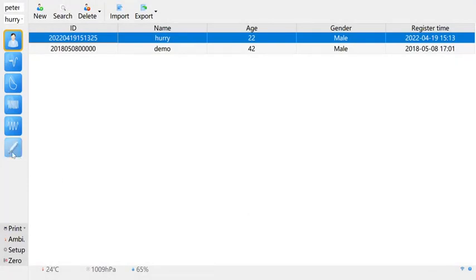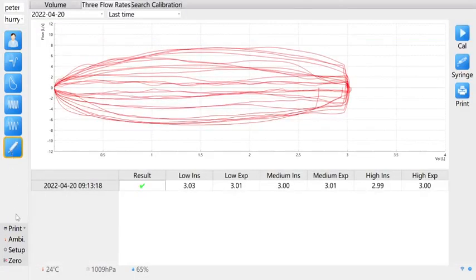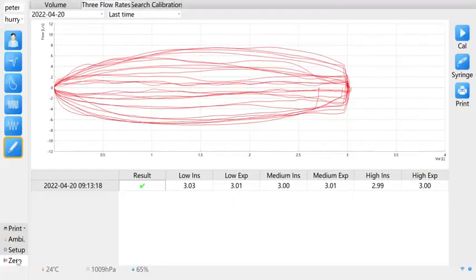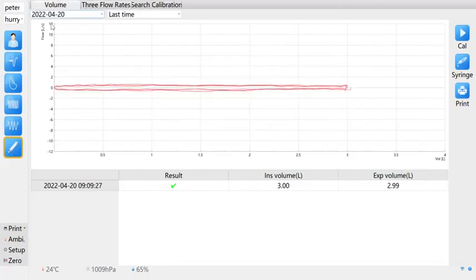Click the sixth icon on the left. Calibrate the sensor first. After the zero calibration of the sensor is successful, enter the instrument calibration interface. Calibration is divided into capacity calibration and 3 flow rate calibration.